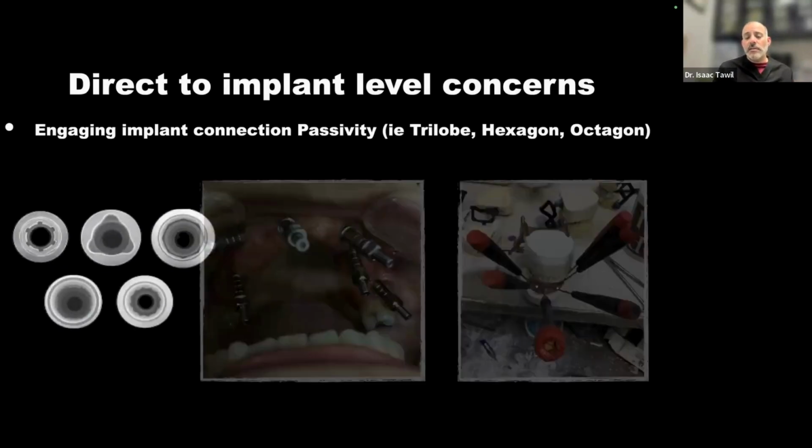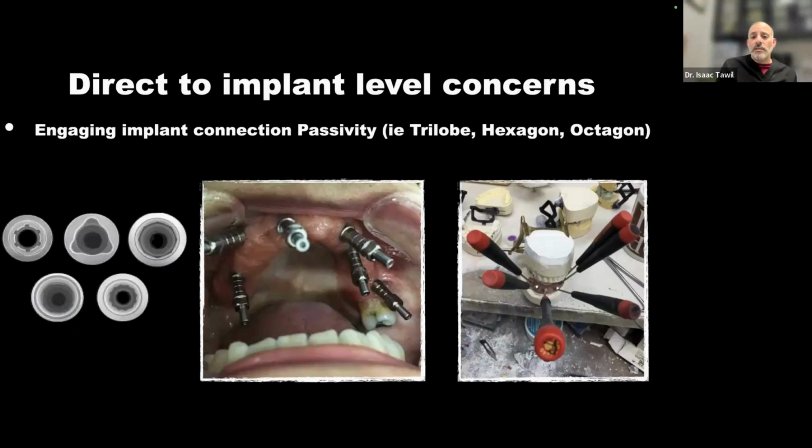All these different angles. And as a lab technician, you look at this and say, what the heck is this? I mean, this is prosthetics gymnastics, as my friend Scott Gans likes to say. How do you overcome all these hurdles in a case like this? Very difficult. You can have facial access holes that are going to look terrible here. They're going to have to try to go and correct. And even using multi-unit abutments in this case might be difficult because how do you even bring those over? You need 90-degree multi-unit abutments for these cases. Hopefully they make it for that implant.